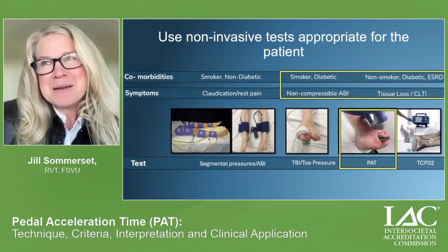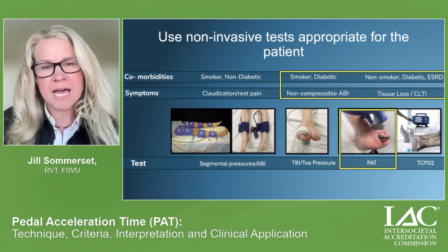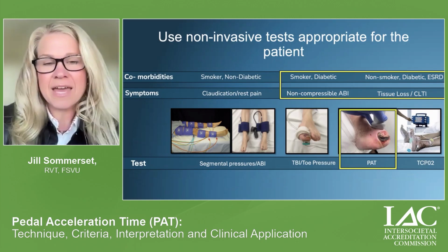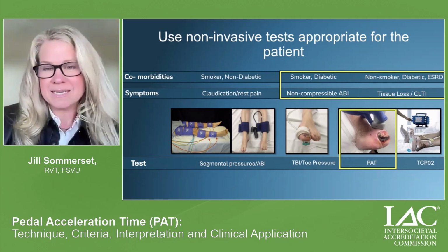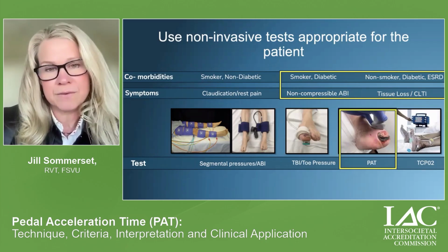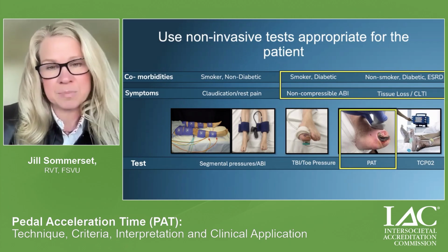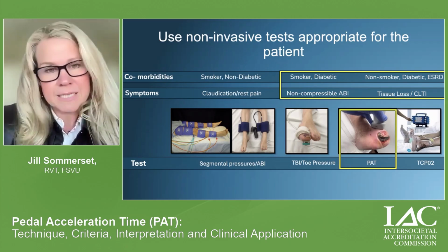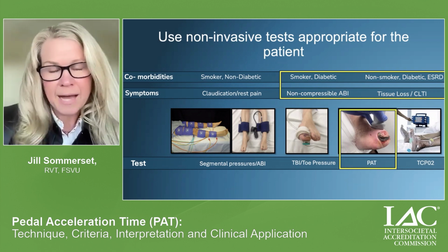So moving on, I'm here to just talk to you about PAT, but we have all of these other non-invasive tools available to us in our toolbox, and they are appropriate to the patient in front of us. So I'm not saying that PAT is the end all be all. I think we have to use the tools available to us in the patient that is in front of us and how they present.